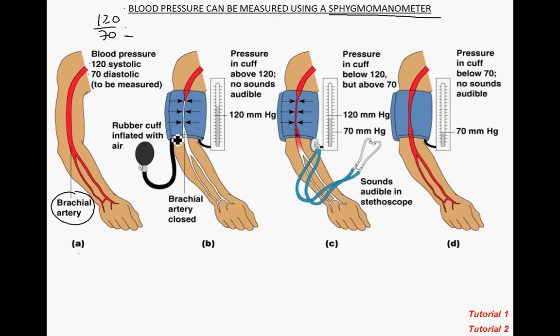To take a blood pressure reading, you place the cuff snugly around the arm. There's a bulb with a valve — initially you want that valve to be closed. When the valve is closed, you pump the bulb to push pressure into the cuff. That pressure in the cuff will occlude or stop blood from flowing through the brachial artery. The cuff pressure needs to be above 120 millimeters of mercury, and you won't hear any sounds through the stethoscope at this point. Putting the cuff on and inflating it above 120 mmHg is the easy part.